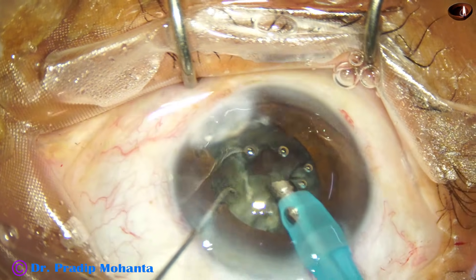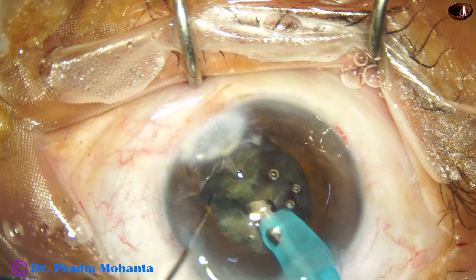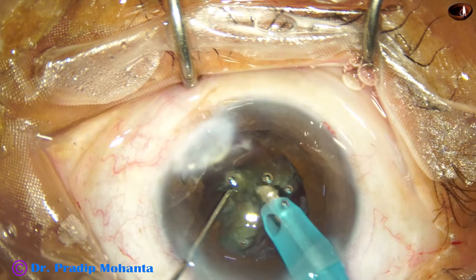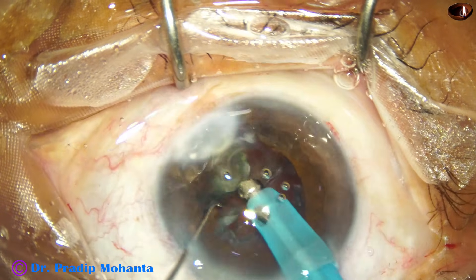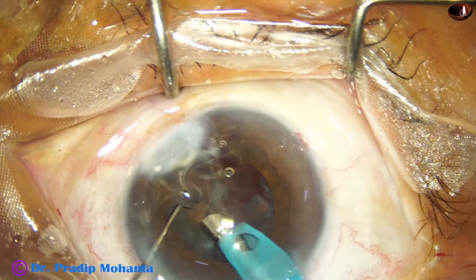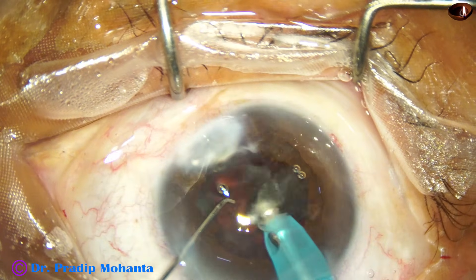The left-hand instrument is a Sinskey hook-like chopper. This has been designed by me — it is just a little bit stouter and thicker than a Sinskey hook. It is known as Mohanta's chopper. The bases are emulsified. Ultrasonic energy used is about 80% in continuous mode, flow rate is 45 ml per minute, and vacuum is 450 mmHg.